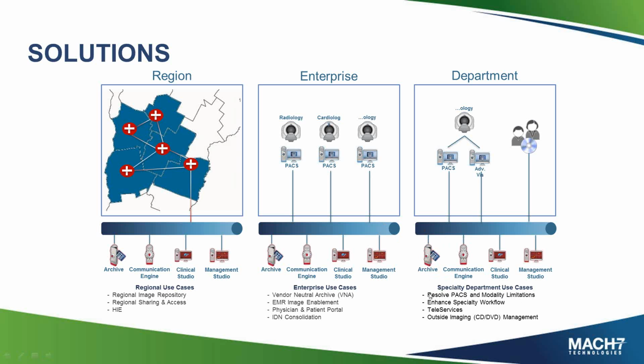If there are specialty workflows you need to do for advanced visualization, you need to split thicks and thins, you need to split chest, abdomen, pelvis, you need to get rid of special characters coming on series descriptions, so hanging protocols work in your PACS, those types of things should be able to be resolved by your enterprise imaging platform.